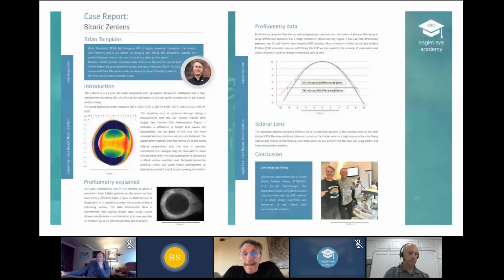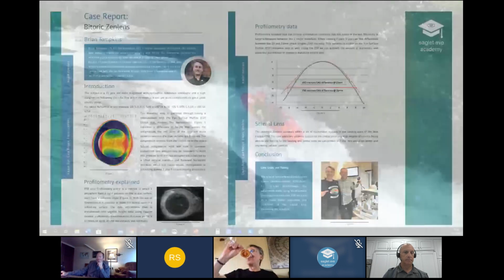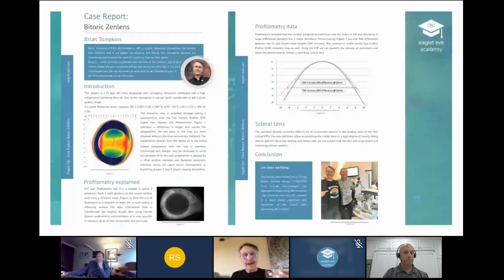Thank you, Brian. Yeah, I'm picking up. Give me a moment. Meanwhile, I was reading a question from Stephen Matthews. Was the haptic on the resulting lens toric? The thing with this lens, and I will move on to the next slide, which is going to explain it a little better.